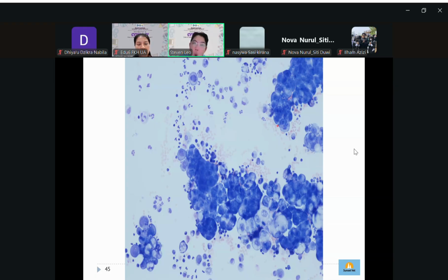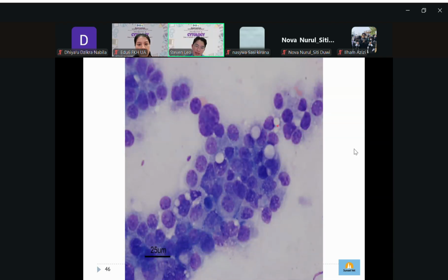because they are growing. Then how about this one, Dr. Stephen? Okay, let's say with the testing one, this is the small, this is the big. Okay, so the cell is growing. And then what else can we see? Let's see what I can see here. Okay, you can imagine this is a cell with the nucleus, and then there is nucleoli in here. Okay, it's more malignant also.